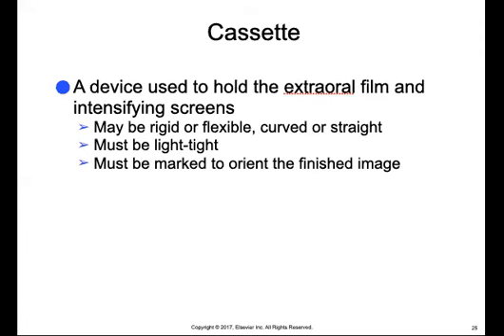And what I mean by this is you have to mark the patient's right and left sides because the panoramic film doesn't have a little bump on it like we are used to with intraoral films. So when the film comes out, it's sometimes difficult to distinguish the left and the right side of the patient. So if this isn't marked before the X-ray is exposed somehow, like by putting a little marker on the film, this should be marked after with a pen or some type of label.